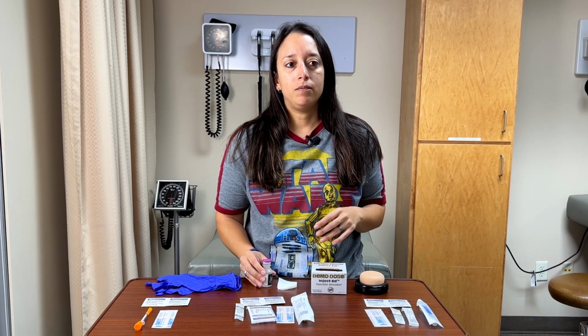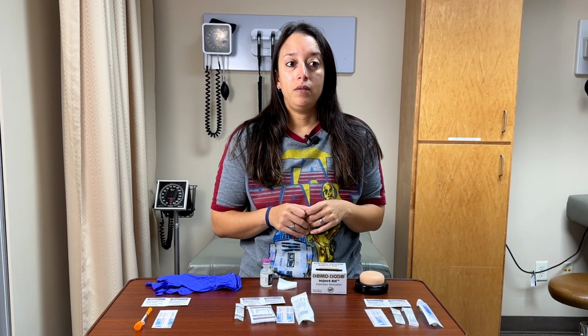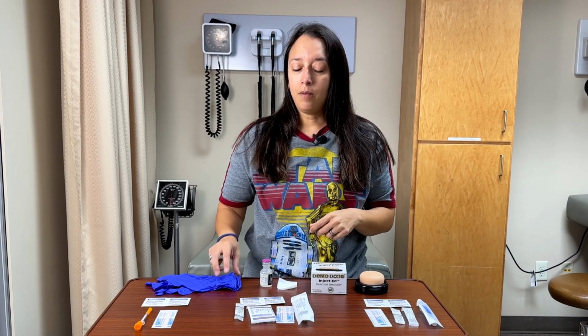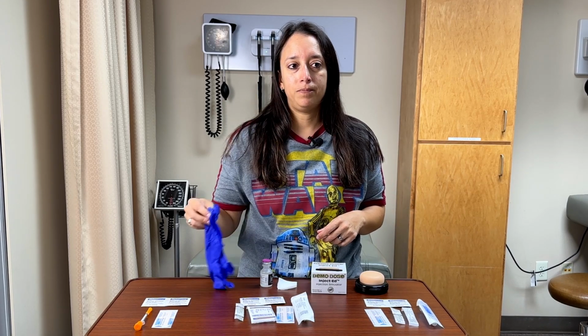We'll put that on the chart. Then we need to look at the anatomical site of the patient. Check and make sure that it's clean and that it's good to go. Then we want to wash our hands with soap and water and dry them thoroughly, and put on non-sterile gloves.